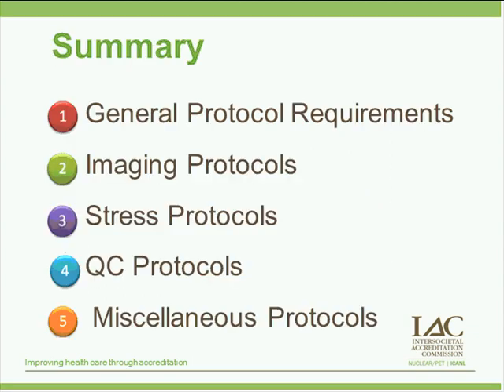In summary, I've reviewed the general protocol requirements and the specific requirements for imaging, stress, quality control, and miscellaneous protocols. Remember when writing your protocols to pay attention to the specific protocol requirements listed in the standards. Make sure your protocols are site-specific and reflect the actual practices performed in your facility. Make sure your protocols are sufficiently detailed to enable recreation of the protocol. And don't forget that there are numerous sample protocols listed on our website that can be customized to reflect the practices in your own facility.